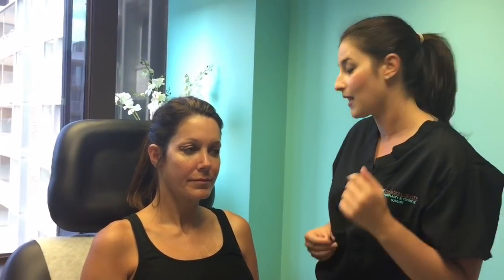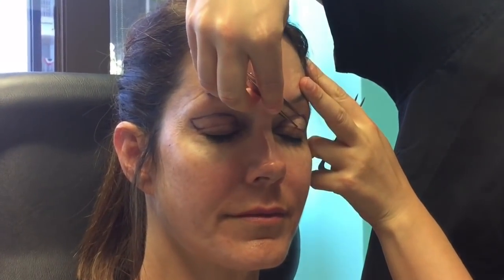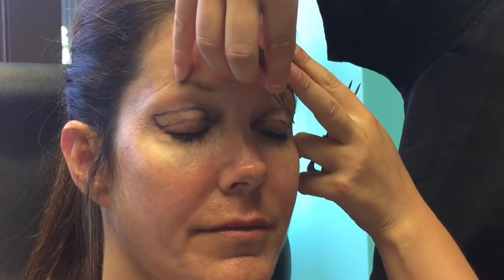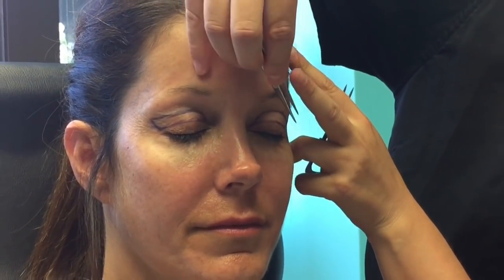After that I use an instrument to measure the amount of excess skin and pinch the extra skin to make sure that not too much skin is taken — giving a very natural amount of skin that's removed. I hold the brow up because we don't want the brow to come down; we always want the brow to be more upright. I pinch to make sure the markings do not produce any movement of the eye that causes eyelid opening, and also do not pull on the brow downward.